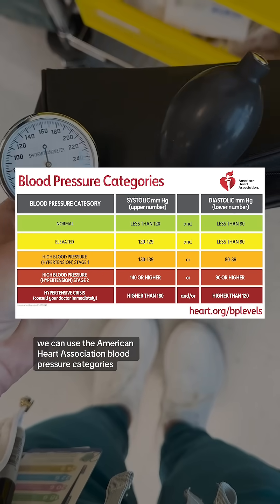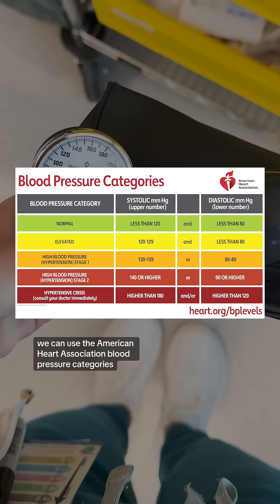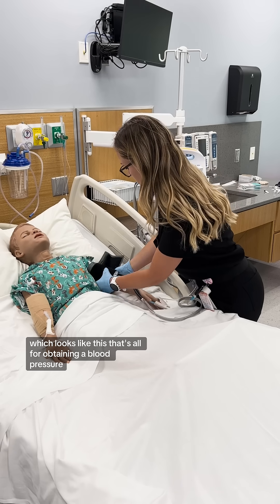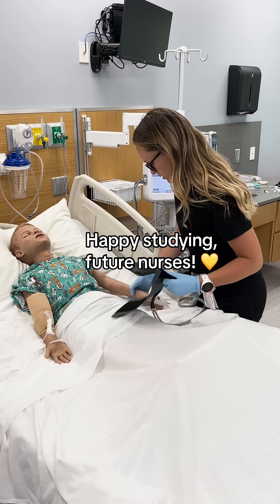To interpret the reading, we can use the American Heart Association blood pressure categories, which looks like this. That's all for obtaining a blood pressure. Happy studying, future nurses.